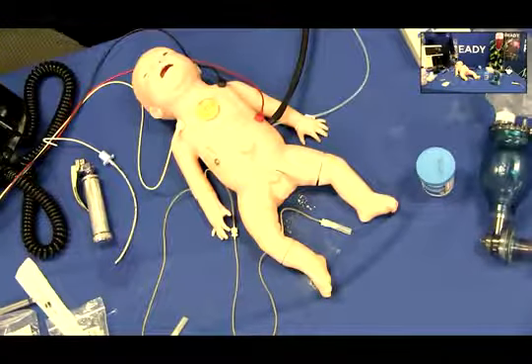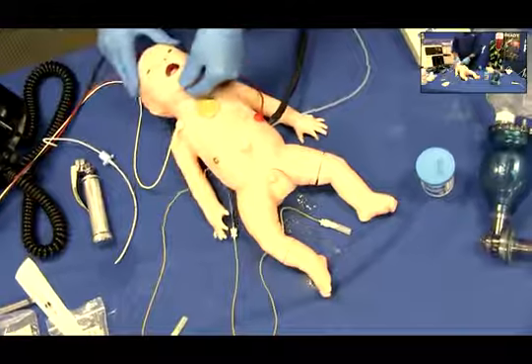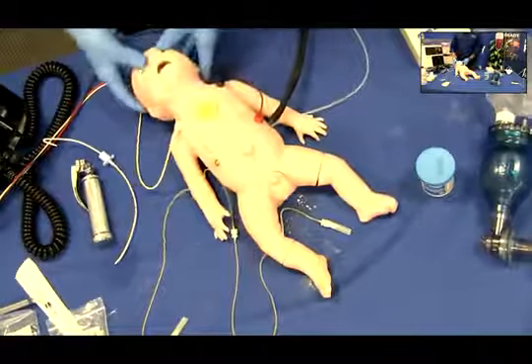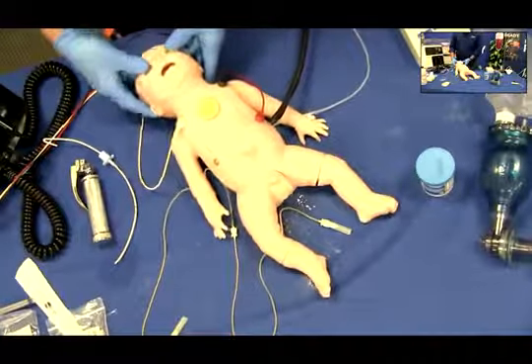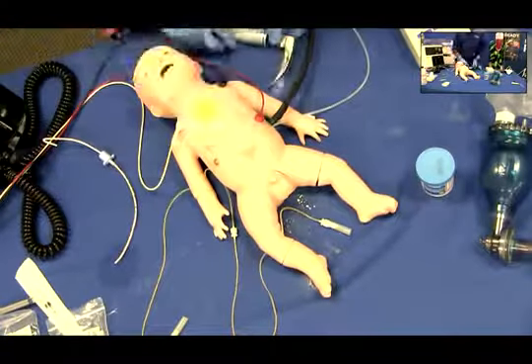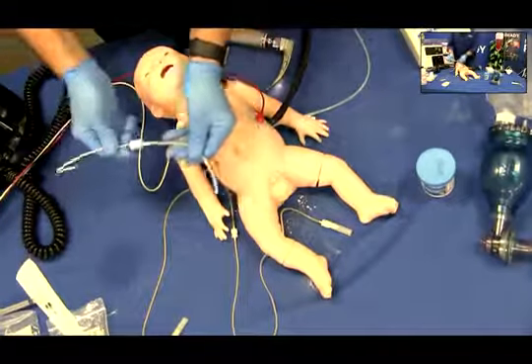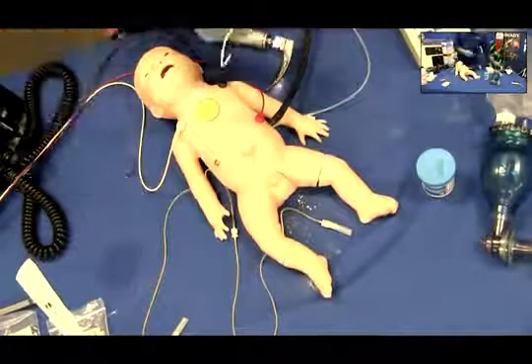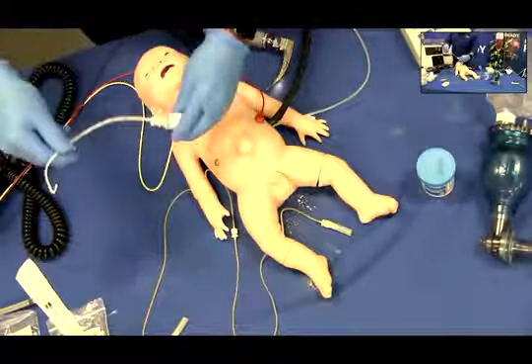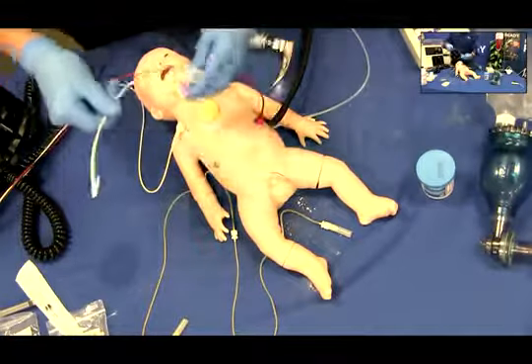Intubation. C.H.A.R.L.I.E allows for normal intubation and advanced or difficult intubation skills to be practiced. A number 1 blade and a standard 3.5 millimeter ET tube or number 1 LMA is needed to practice airway management skills. Always be sure to generously lubricate the recommended equipment with the lubricant provided.